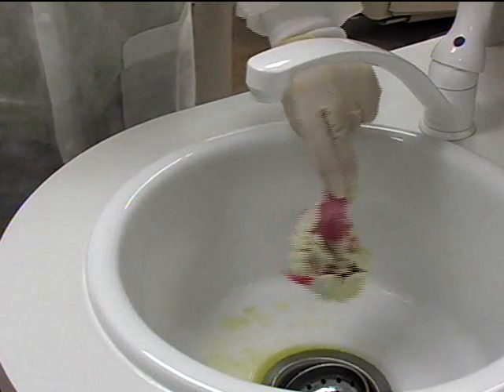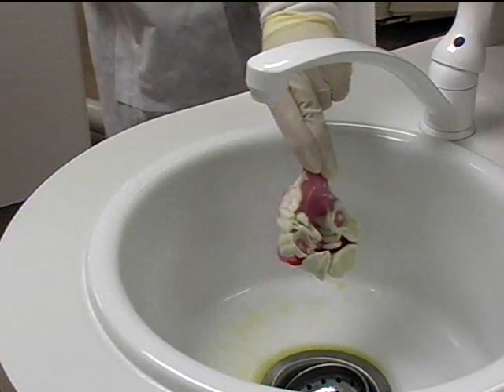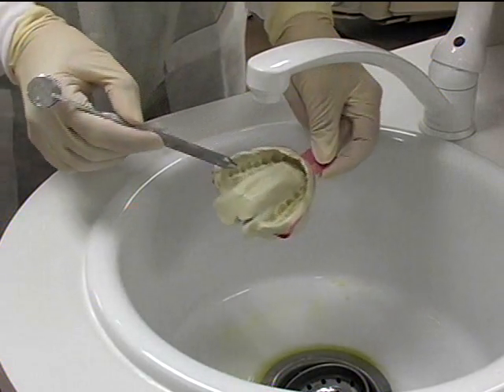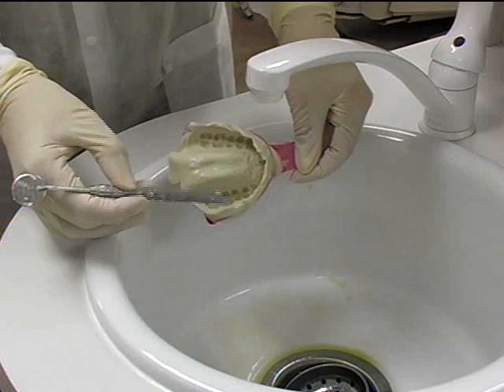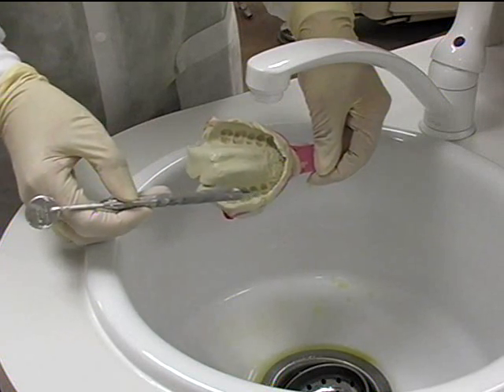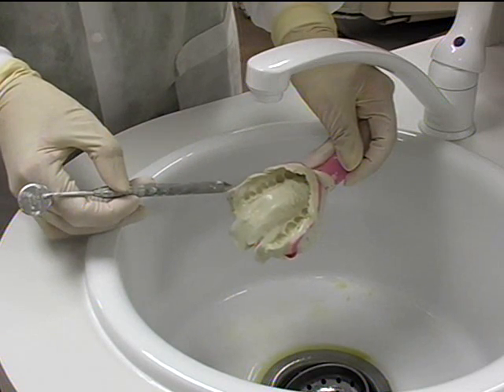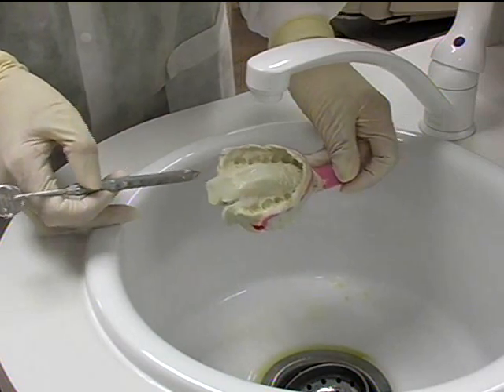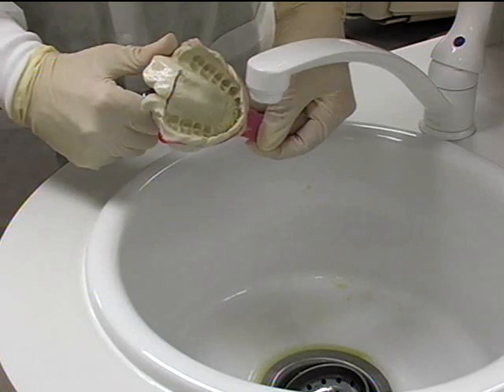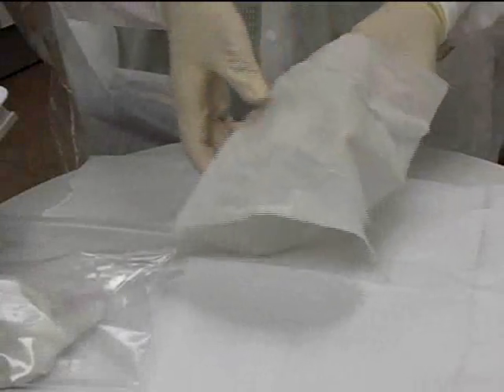Shake off excess solution and inspect for proper reproduction of hard and soft tissues: vestibular roll, buccal and labial frena, tuberosity and hamular notch. Remove unsupported material with a knife. Cover with damp gauze or a napkin.